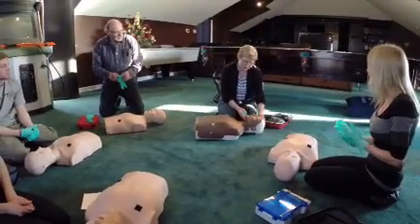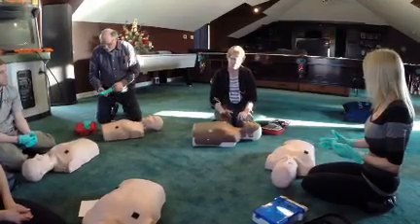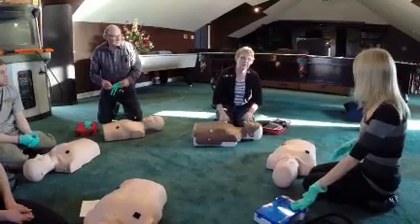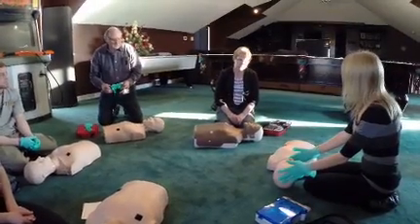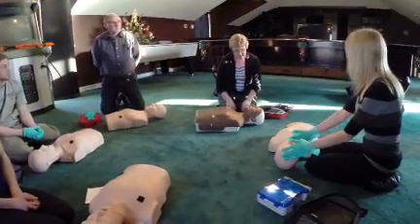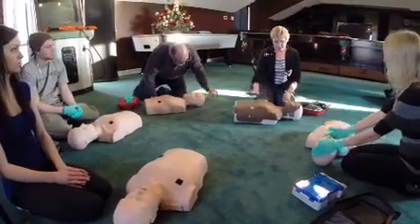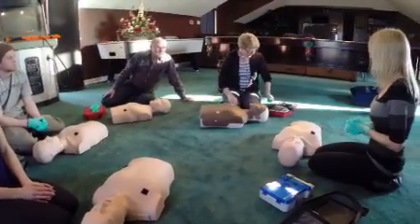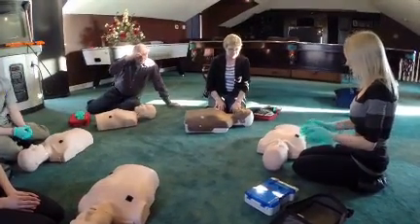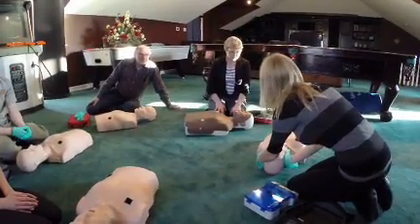I do have another question. So do you change the airway, like do you adjust the head or anything like that before you do it? Not the AED machine, the person that's laying there. Sometimes their head would be crooked or something like that. Only if you're going to perform CPR. When you go to perform CPR, then you're going to do the head tilt. But before that, before you do any of that, would you do anything, adjust? No. It depends also on their injury, right? Because if there's a head or spinal injury, then you don't want to touch them. Then you're probably going to have somebody holding their head.